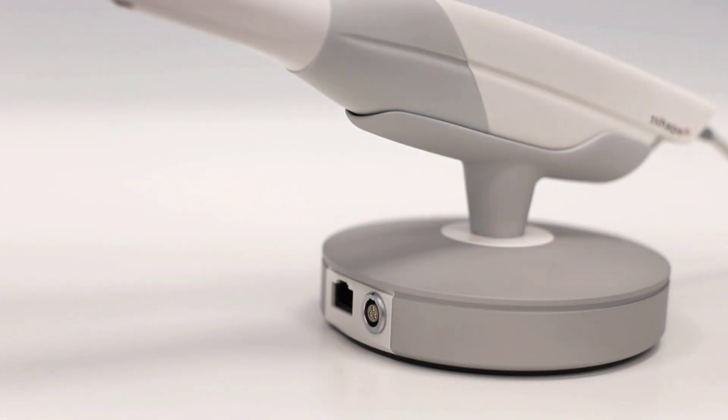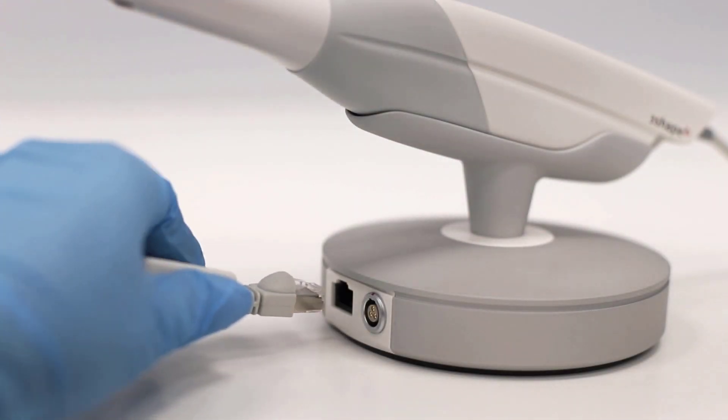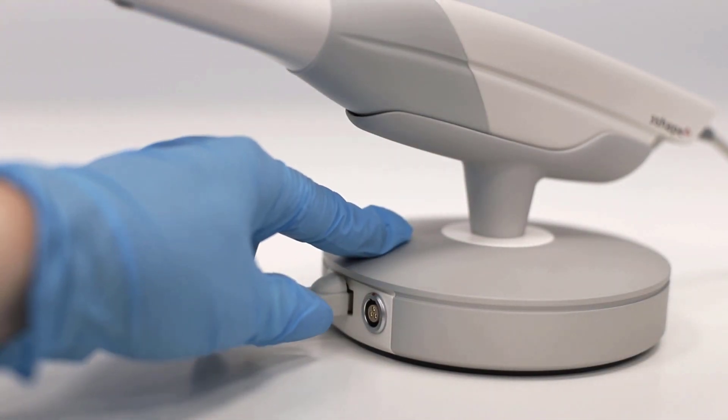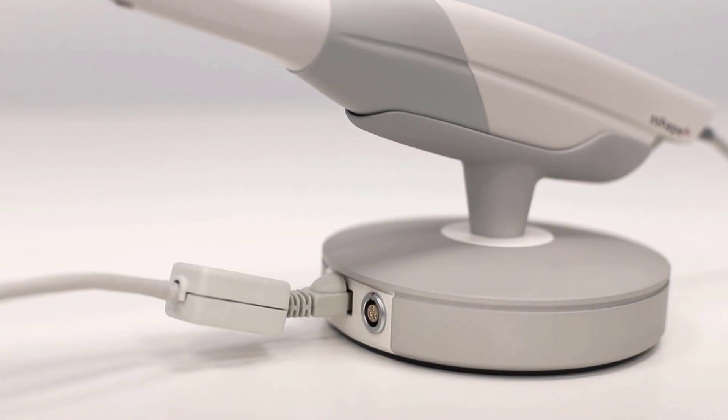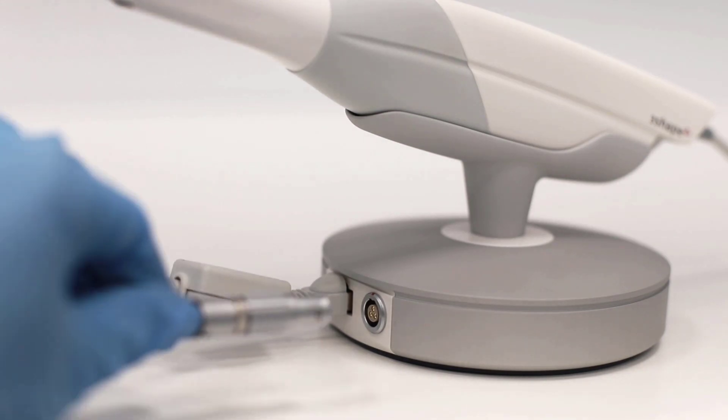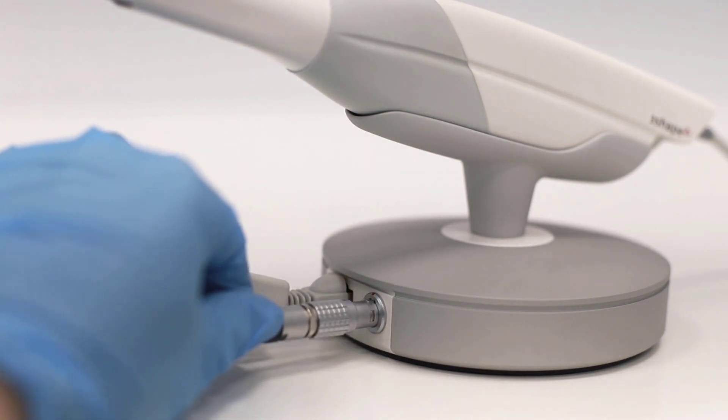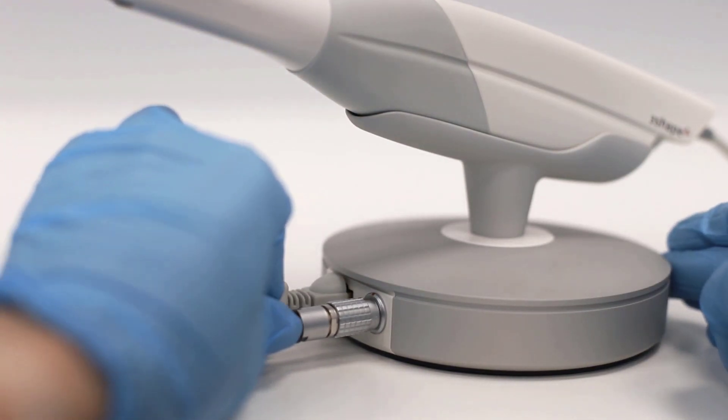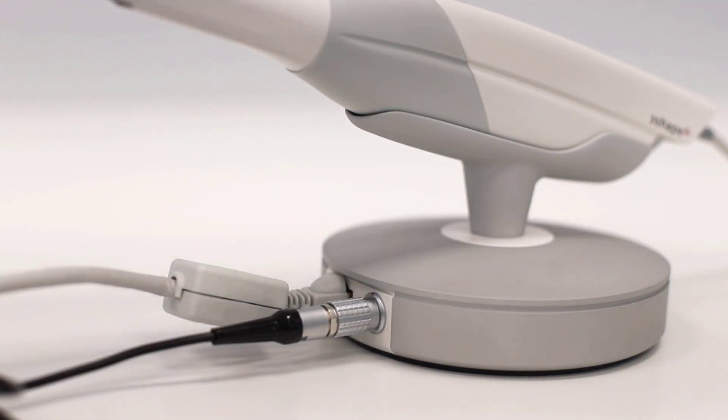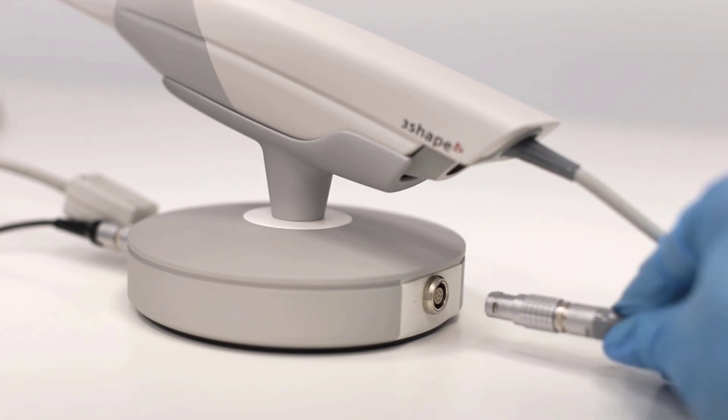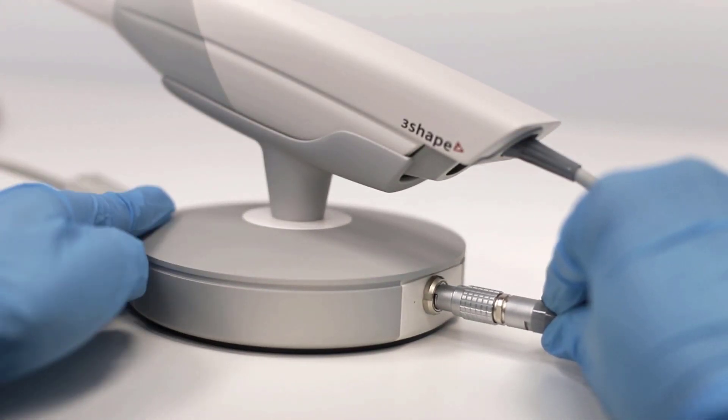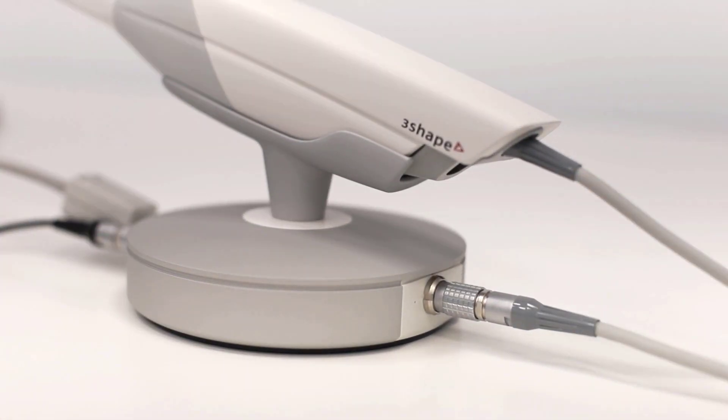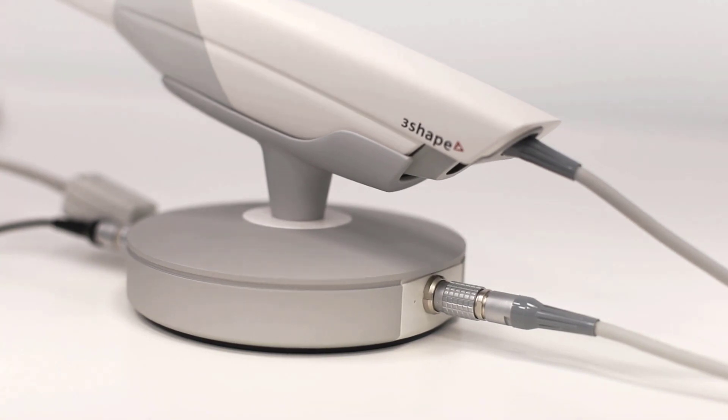Each cable fits into a single connection. Ensure that the red dot is pointing upwards. Remember that during the connection, do not force any plugs. Press only very gently. If something doesn't fit, check the wire or the port.